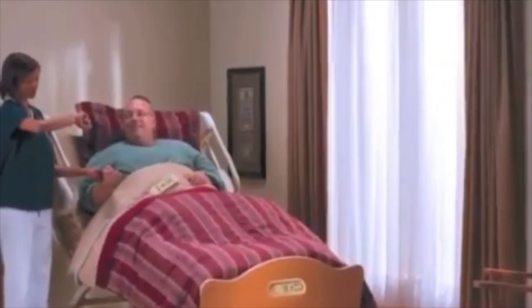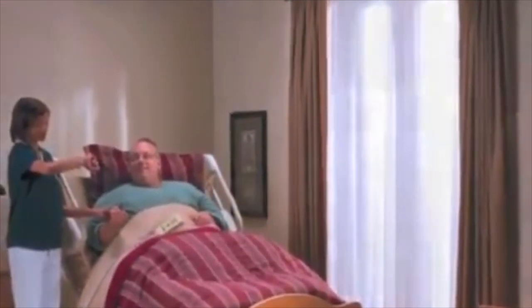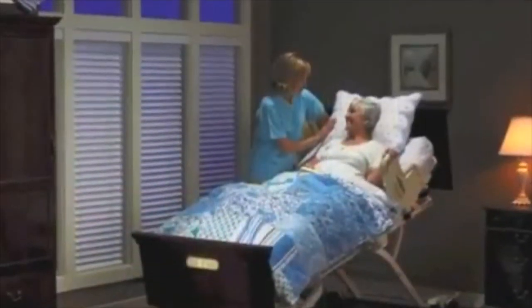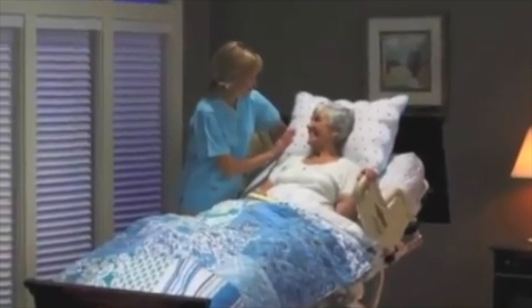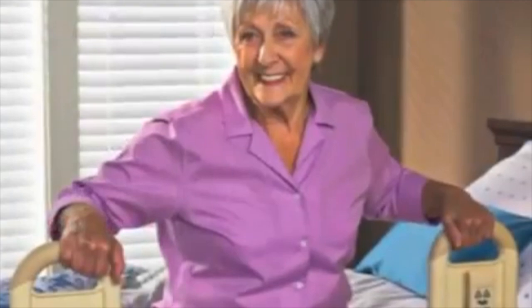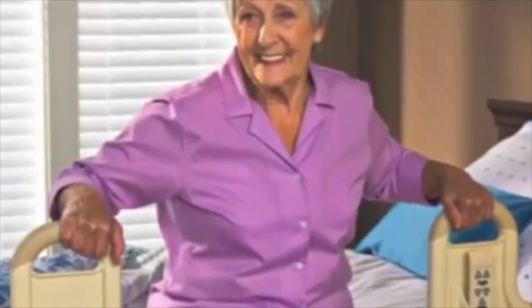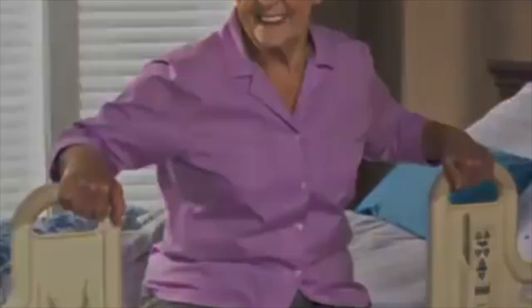The UltraCare XT creates a true edge-to-edge 500-pound safe working load. This means added stability and security when friends and family come to visit. If a resident would benefit from using assist handles, please bring this to the attention of your supervisor. An assessment must be provided and documented in the care plan in order to utilize this device.